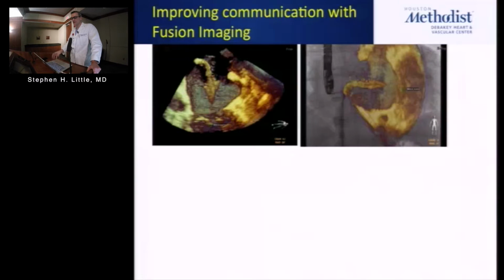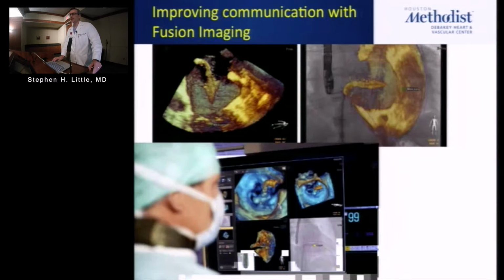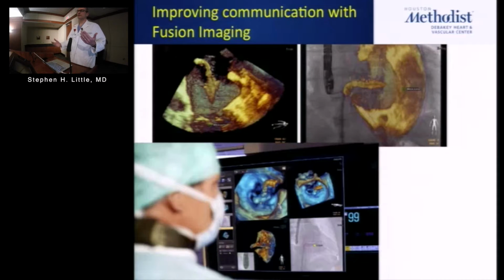So the idea is that bringing all these together into one environment is important, and there are lots of different vendors working on this. Dr. Barker and I are doing some animal work, working with one particular vendor to see how robust this technology really is. The idea is you combine both the echo data set and the fluoro data set on one screen, and instead of having to look back and forth and do this mental interpolation of what this image is in relation to that image, you put them together in what's called fusion imaging.